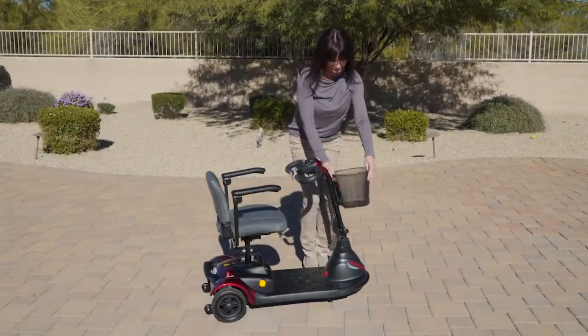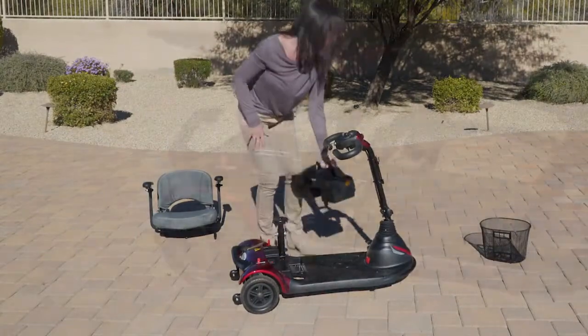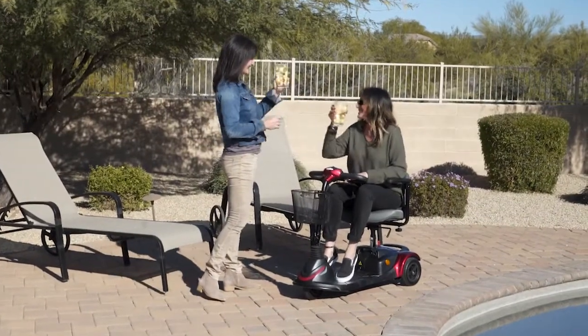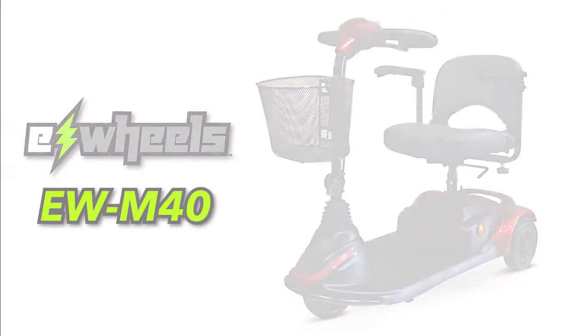The EWM40 also features a wireless electric connection that enables the scooter to be easily disassembled in just seconds to make transporting the scooter more manageable. This makes it a breeze when you need to pack your scooter up for traveling. So if you're looking for a lightweight, portable scooter with loads of features at a great price, look no further than the EWM40 portable mobility scooter.